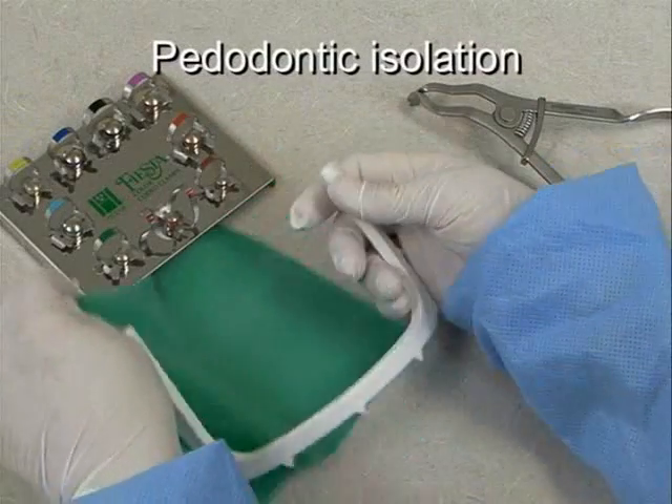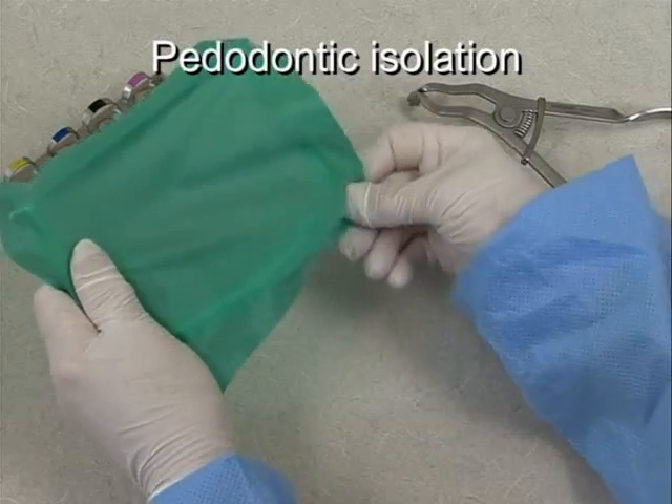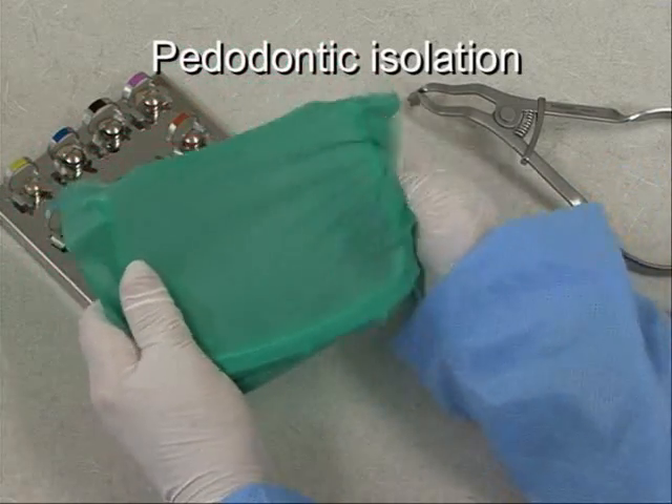The paedodontic patient may present challenges while performing dental procedures. Therefore, the use of the dental dam is crucial to a successful clinical outcome.